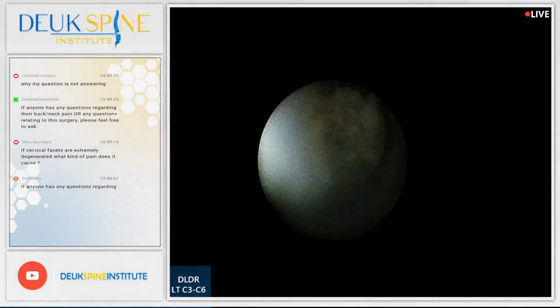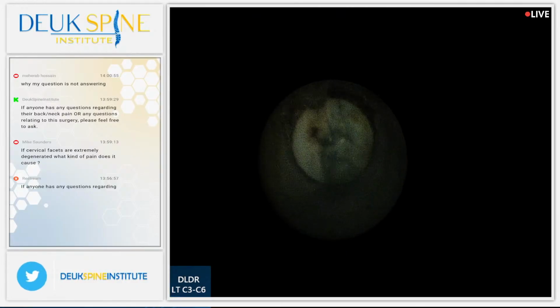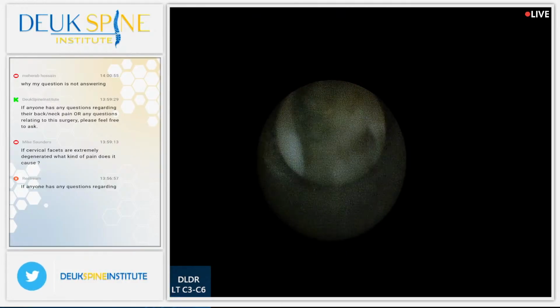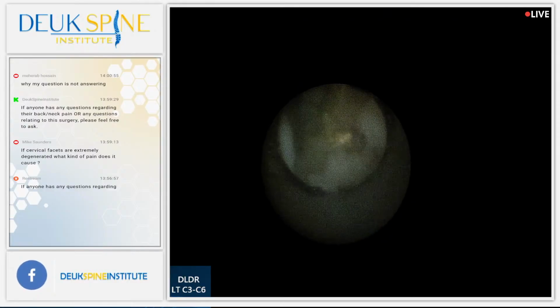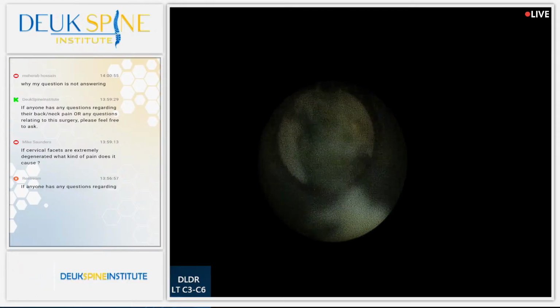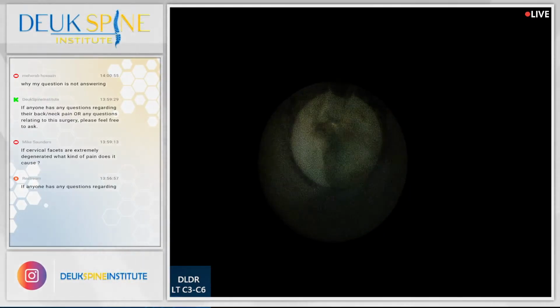Tall herniation, wide herniation. Wide base, they call it, just like a mountain. I don't know, guys, I'm just not happy with the performance of this fiber. It normally shakes all these little pieces out, and they're just not shaken out.